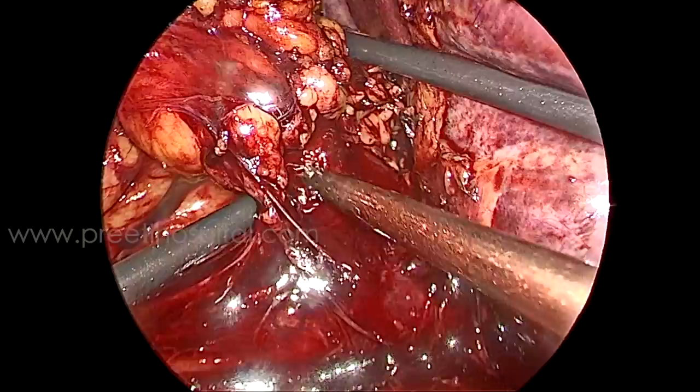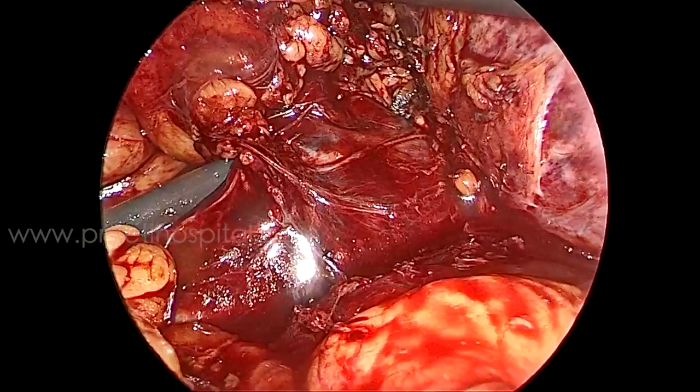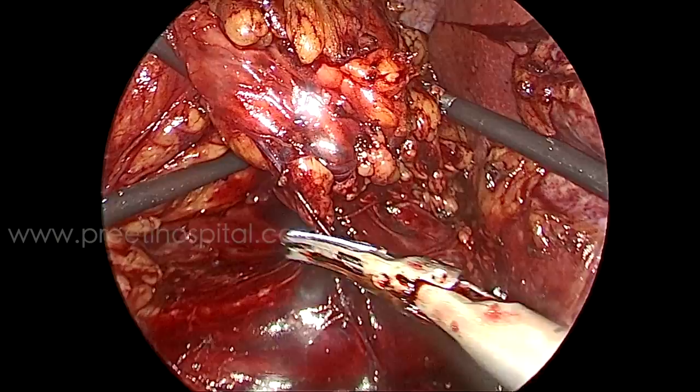There is one large vein and next to it one more vein. Our feeling was that we can sacrifice this vein instead of repairing it. But what we decided was to mobilize the kidney first and leave it here. My metal clips have controlled about 90% of the bleeding — I can wait and take action. If it were a single vein, we might have gone ahead differently.